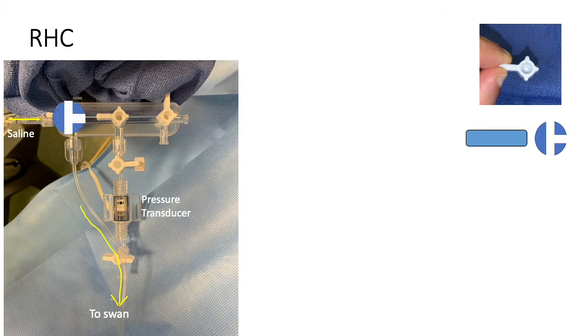Speaking of valves, this is how the valves are currently aligned. Now with this setup, you will see that the pressure transducer is effectively communicating with the air. This is how we zero our transducer.